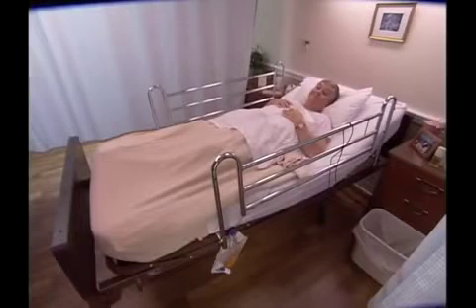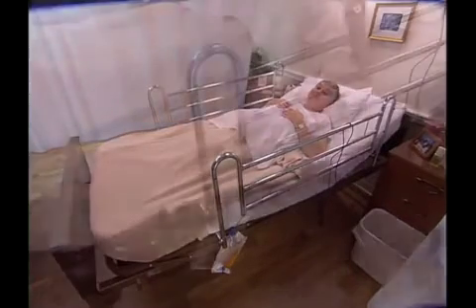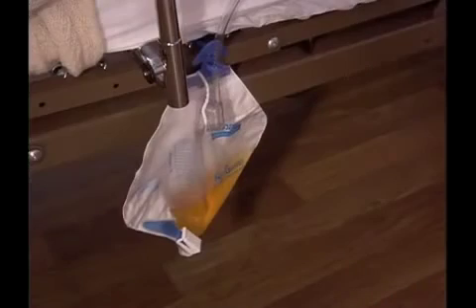Coiling the tubing and securing it to the bed linens also keeps the weight of the tubing from pulling against the person's body. In the bed, the drainage bag is secured to the bed frame, never the side rail, again at a level lower than the person's bladder. This prevents old, contaminated urine from running back down the tubing and into the person's bladder, causing an infection.